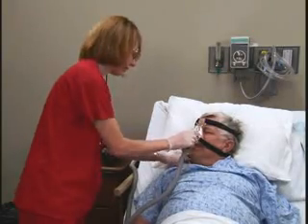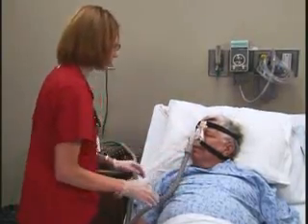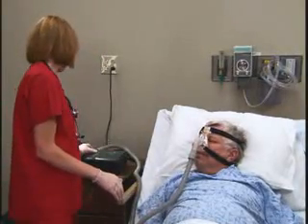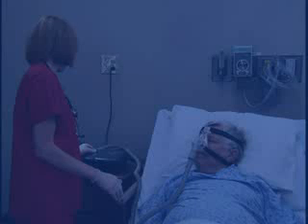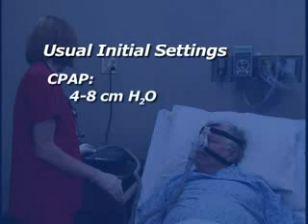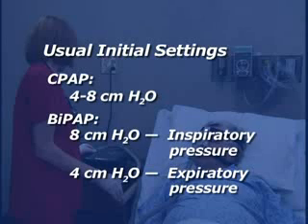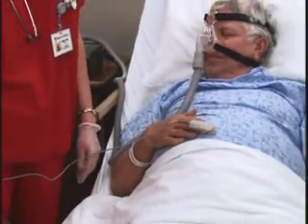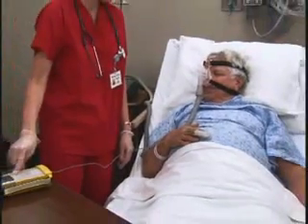Breathe normal, in and out through your nose. For CPAP, the initial settings usually are 4 to 8 centimeters of water. For BiPAP, they usually are 8 centimeters of water for inspiratory pressure and 4 centimeters of water for expiratory pressure. If the patient is not already on pulse oximetry, connect him to it.